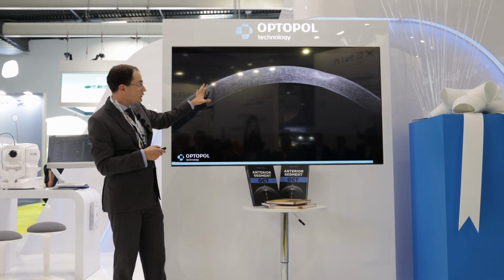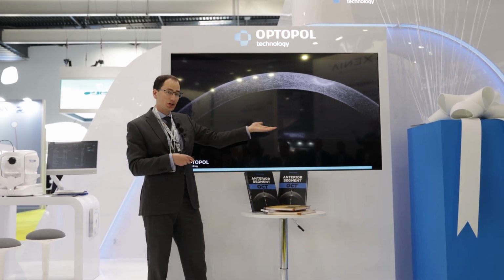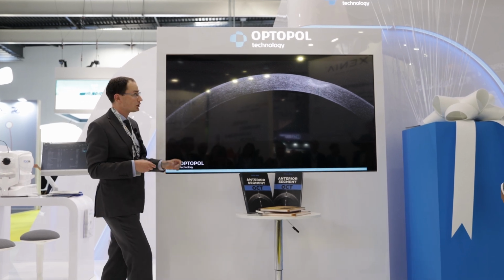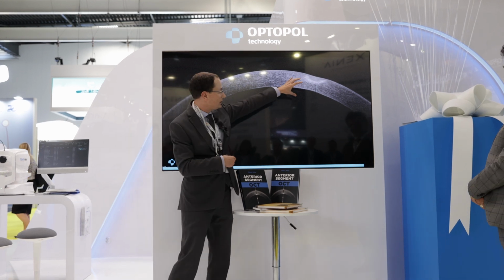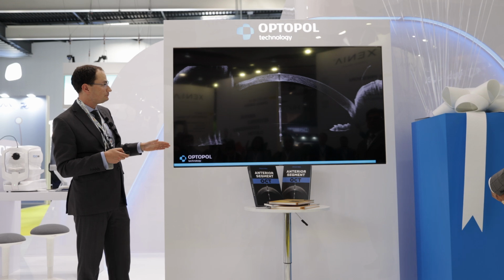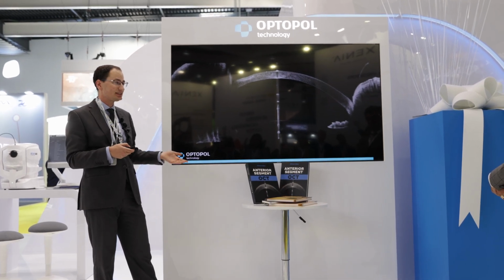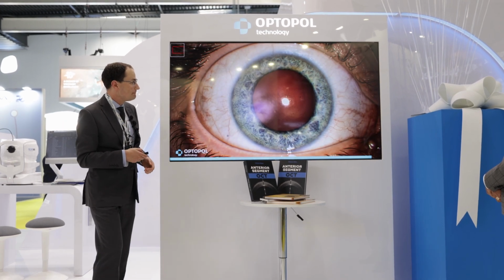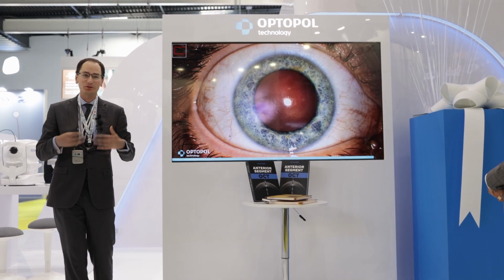If you do the anterior segment scan, you can see everything that you saw on the maps. You see scarring, and you see the corneal epithelial thickening due to the compensation of the thinned stroma. This is the wide field scan. The girl doesn't have keratoconus, she has astigmatism coming from a previous inflammation. And this is something that such books are made for: dystrophies.